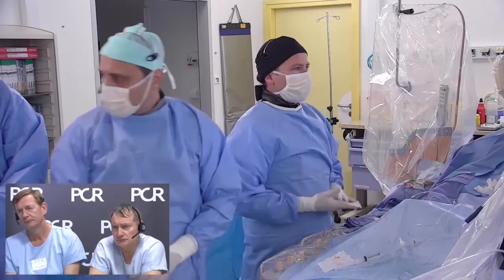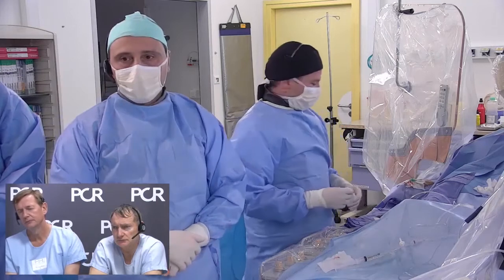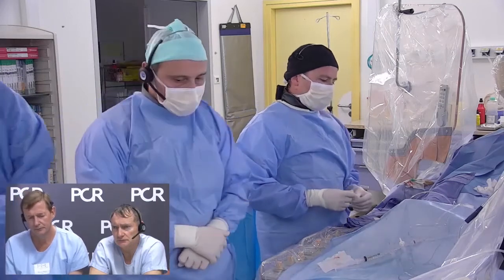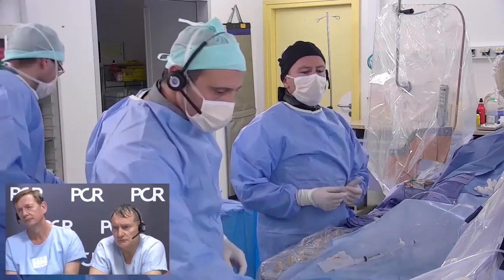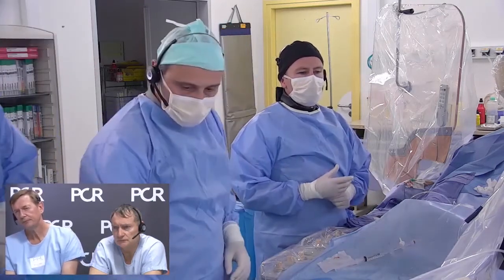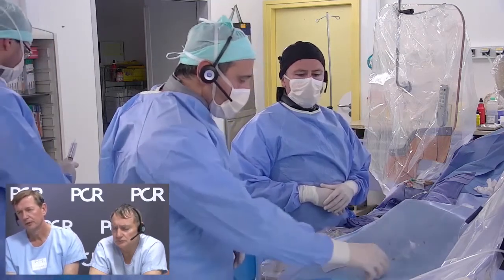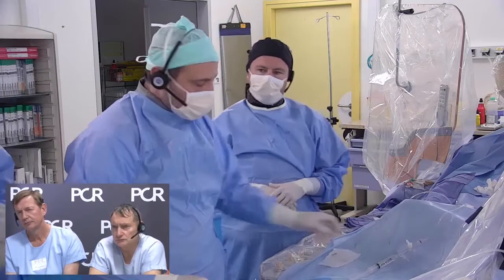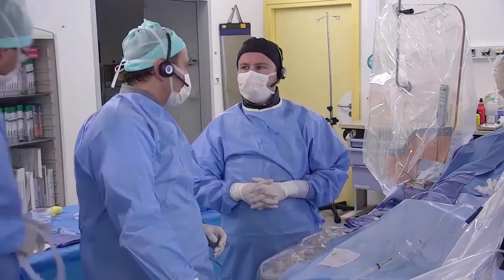For this lesion, I don't think I need it, but if I had failed to advance it, our option would have been to use a microcatheter or an over-the-wire small balloon to exchange the workhorse wire with the rota wire. Nicolas, I think now we need to decide on our rotablation strategy, and first of all, we need to decide on the burr size.